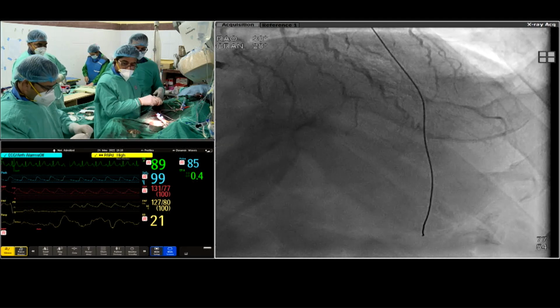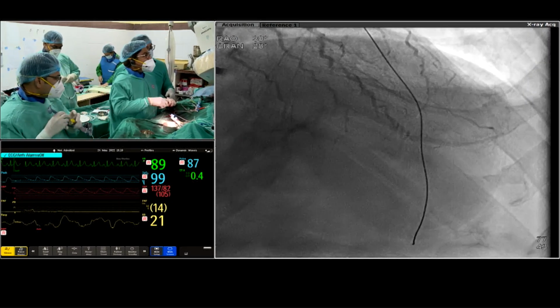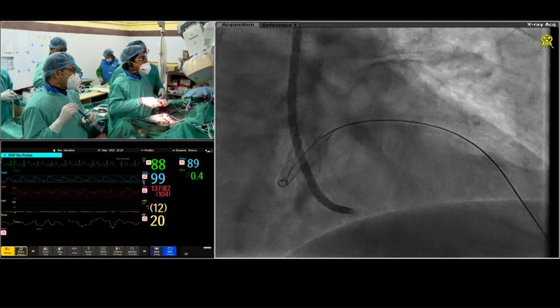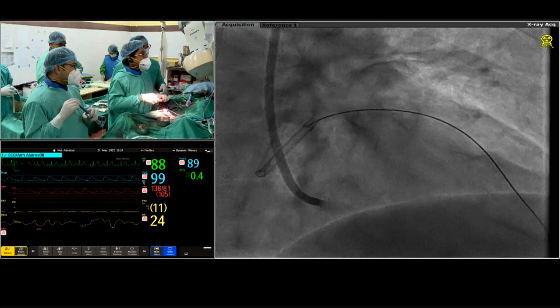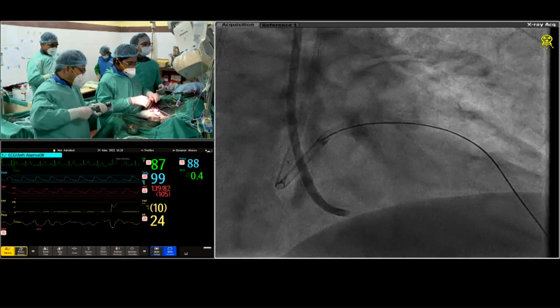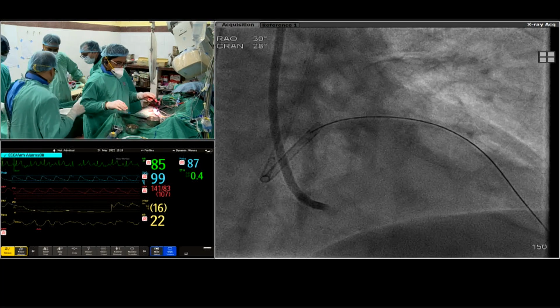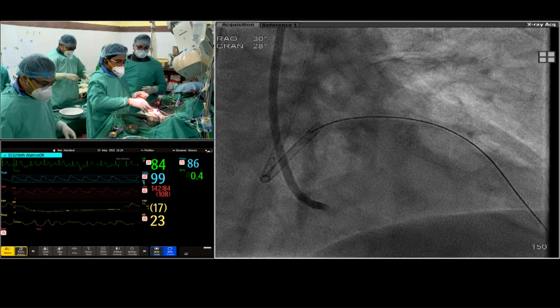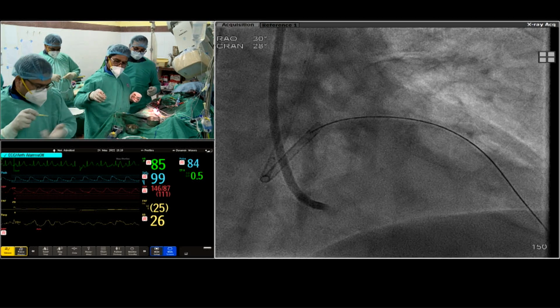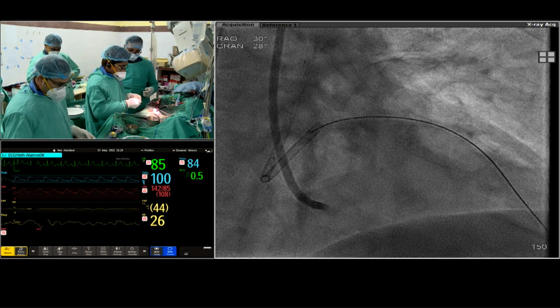This 2.5, na? Confirm. Okay, come. Trap. Okay, micro. 130. 150 is only when you are going to the retrograde channel.